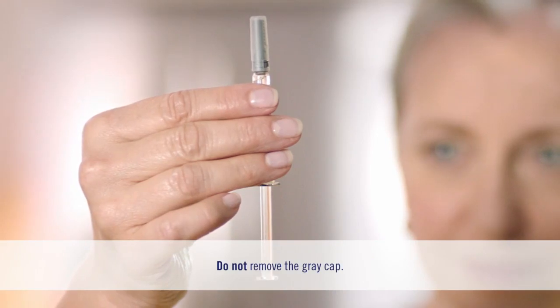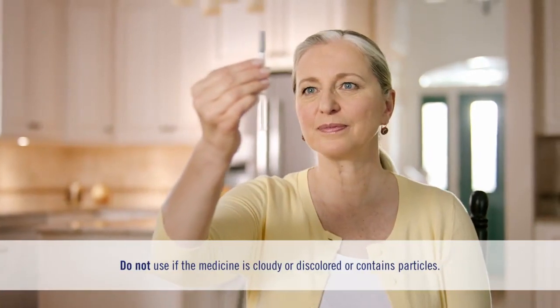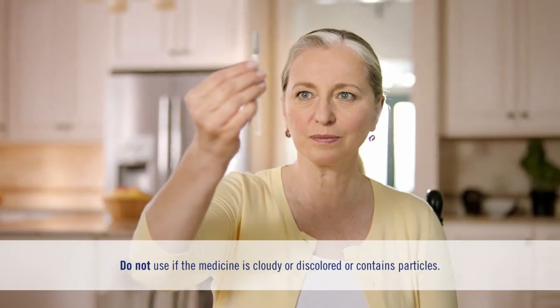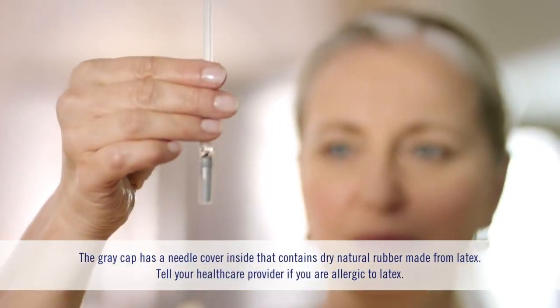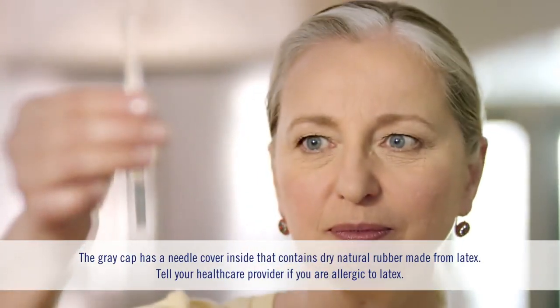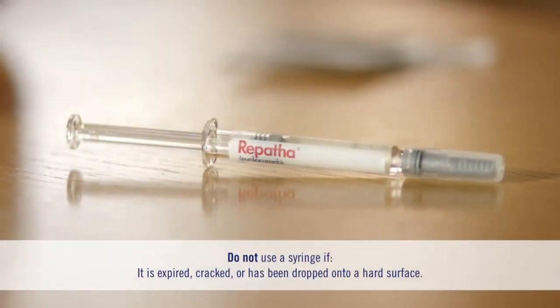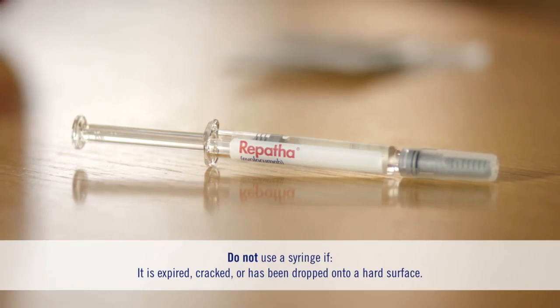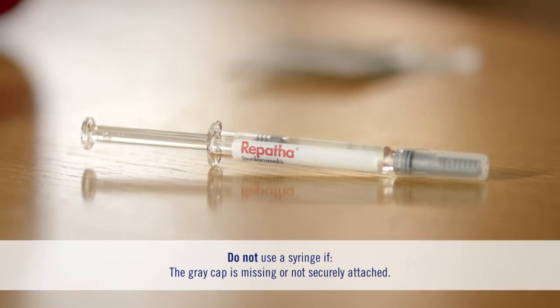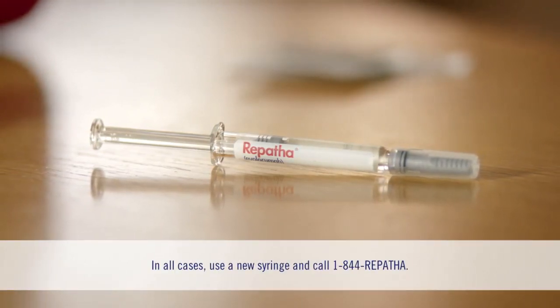Don't remove the gray cap just yet. Look at the medicine in the syringe window — it should be clear and colorless, but it's okay if the medicine is slightly yellow. Check the expiration date; you don't want to use an expired syringe. Look for any cracks and check that the gray cap is in place and securely attached. Never use a syringe that's cracked, missing the gray cap, or was dropped onto a hard surface. If you have any questions, call your doctor, pharmacy, or 1-844-REPATHA.